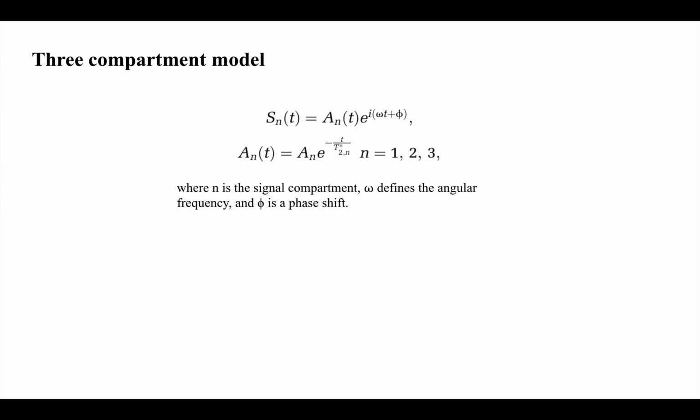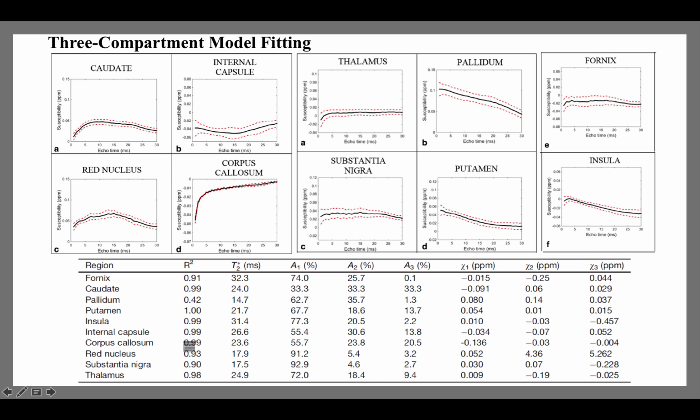All 10 brain regions were fitted onto a 3-compartment model. The table provides the result for 10 brain regions investigated by fitting the values used to parameterize the 3 susceptibility compartments. The adjusted R-square value is representative of the quality of fit achieved. For 9 out of 10 brain regions, the fitting process resulted in an adjusted R-square greater than or equal to 0.9, implying a very good quality of fit. For pallidum, a good fit wasn't obtained.